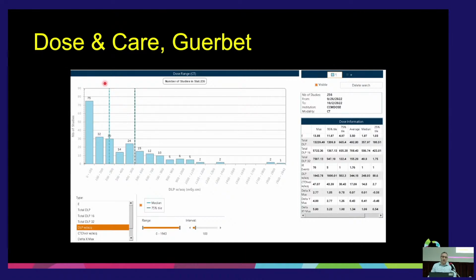The thing I would mention though is you have to be careful when you set these thresholds. We initially went in and set up our software and we didn't realize that the thresholds had actually been set real low. And so every time we got a study, and we were getting quite a few studies that were exceeding our alert level, we were getting email after email after email. So you need to make sure you set your threshold at an appropriate level.